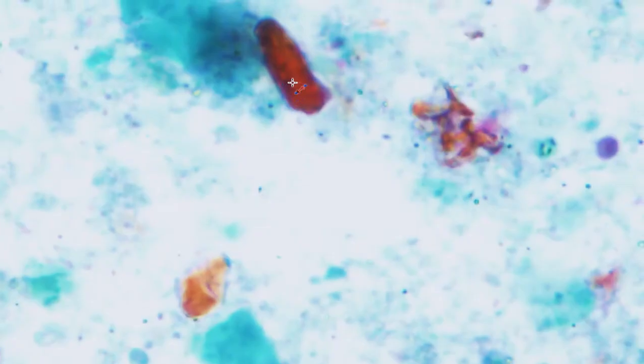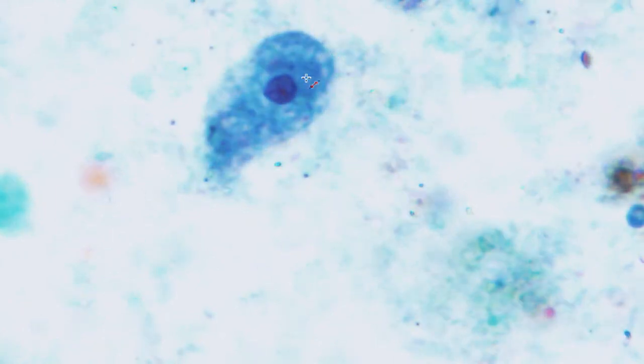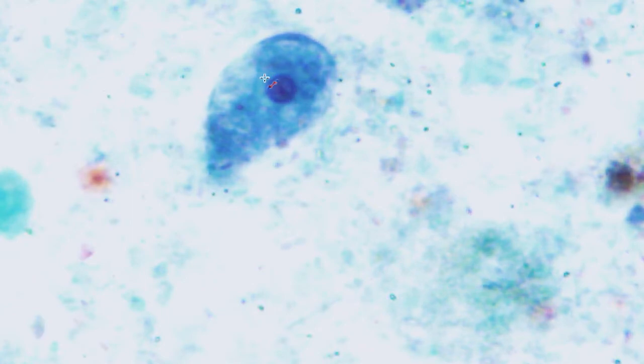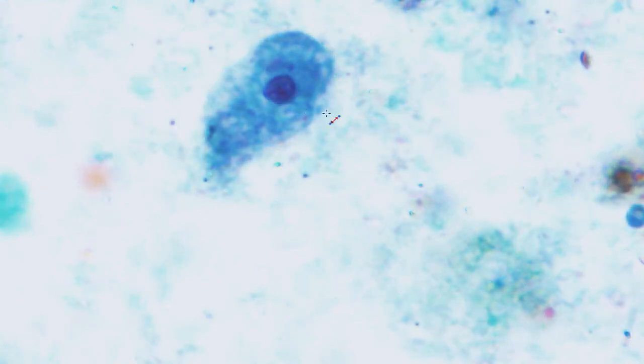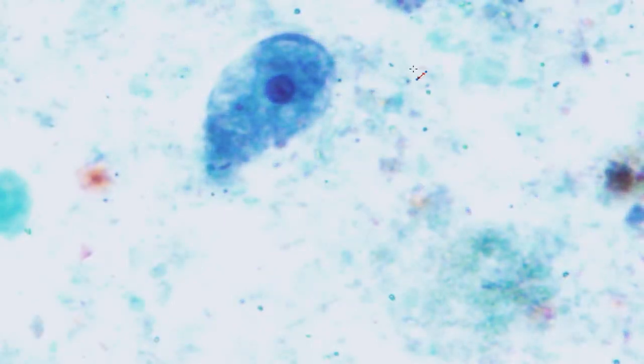So you have to sometimes search a little bit to find what you're looking for. If you're lucky, they'll have lots of trophs present, but sometimes there are very few. Here's a nice one here. What can I see? Well, I see the karyosome is somewhat eccentric. The peripheral chromatin looks quite even, but it may be slightly blotchy. You can see there's a bit more here than on that part there, but eccentric karyosome, blotchy, bit of stuff in that cytoplasm, which is the ingested bacteria.